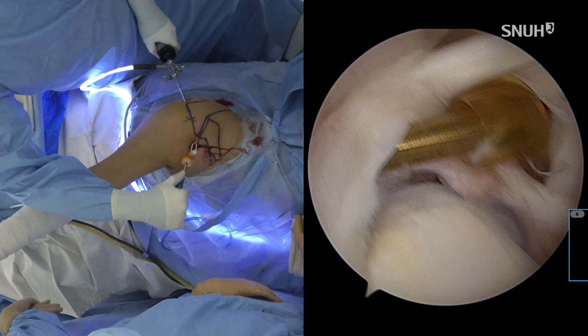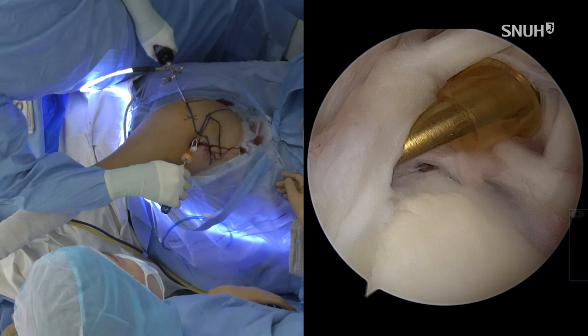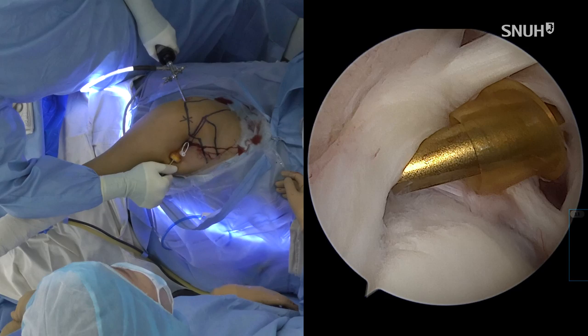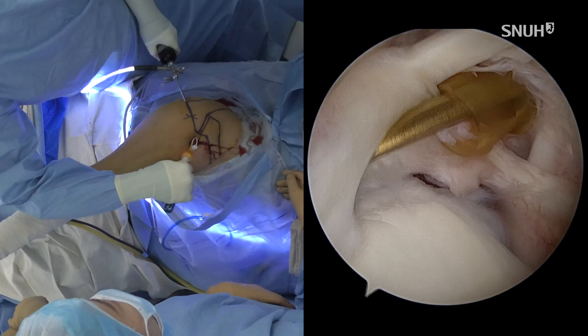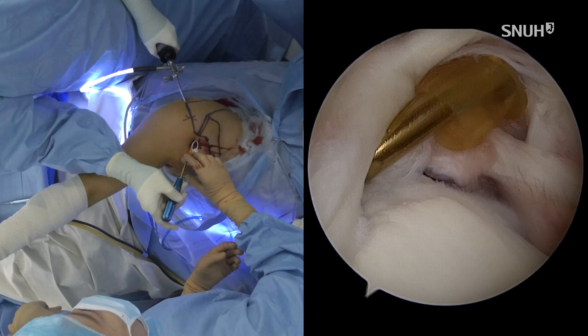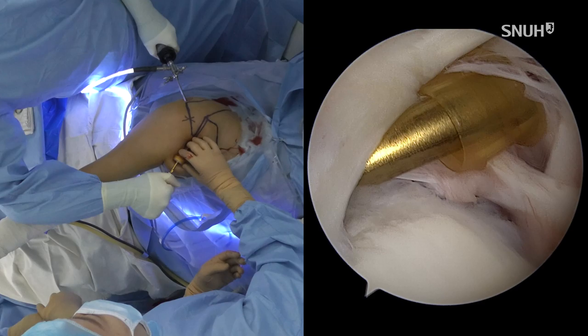Sometimes it is easy, but sometimes it takes a long time. You have to look at the cyst carefully on the MRI, whether it is a multilobulated cyst or just one big cyst. Usually I can decompress the cyst through the anterior cannula. But you have to be careful about suprascapular nerve injury, because the suprascapular nerve is located around 2.5 centimeters medial to the glenoid, the superior glenoid tubercle.